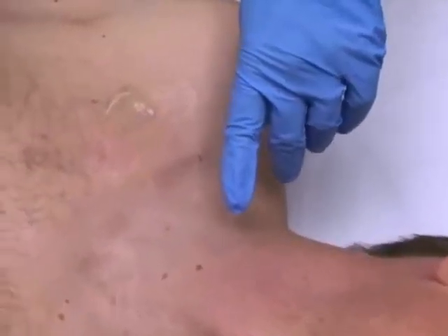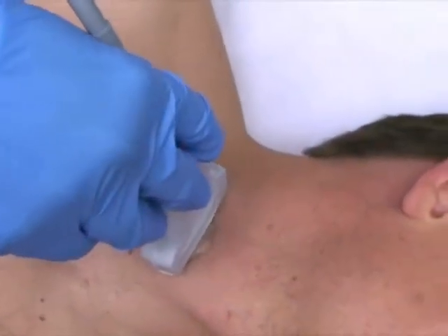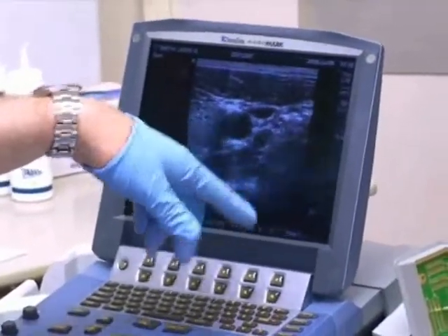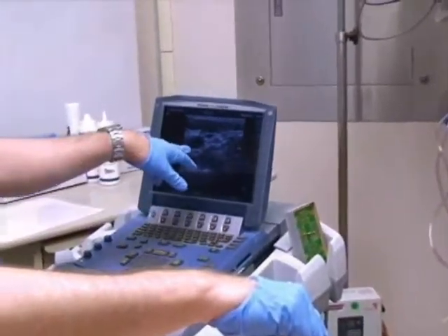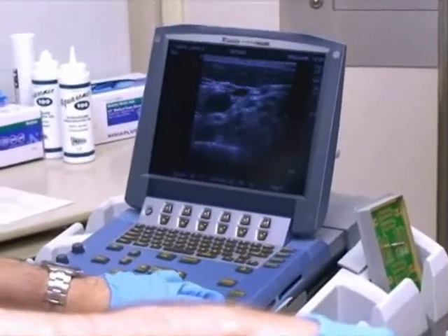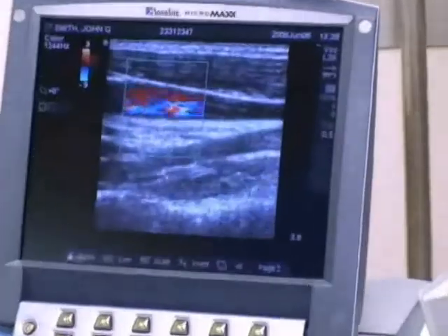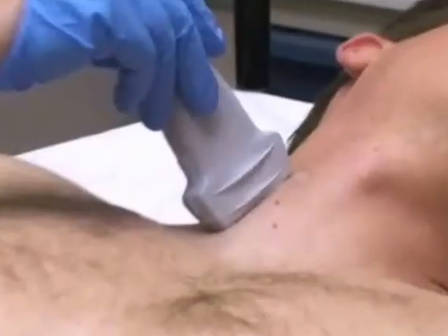Now let's turn our attention to the internal jugular site. Notice the pulsatile location of the vein and the adjacent artery. General compression indicates that the vein is collapsible while the artery stays open. If desired, the vascular nature of these structures can be confirmed with the use of color Doppler. You can turn the probe lengthways or crossways with the vessel to take different views.